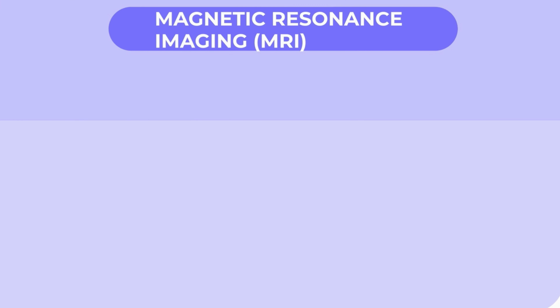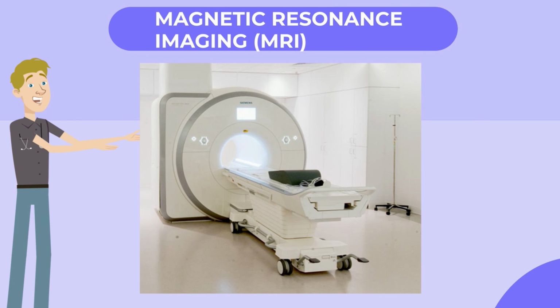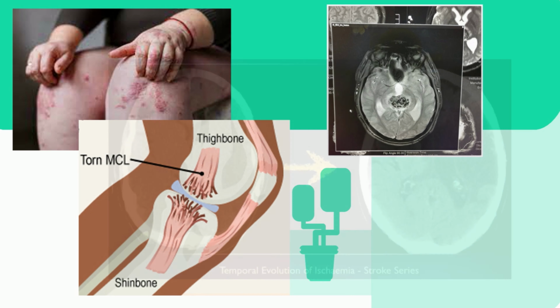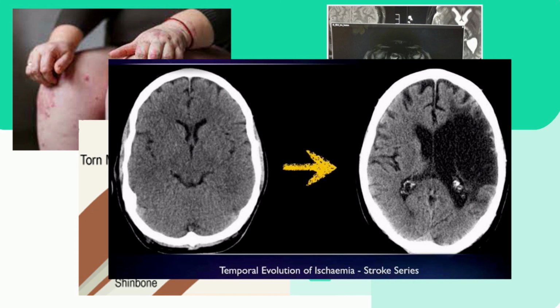We are from Group 5 and our title for the presentation is Application of MRI, or known as Magnetic Resonance Imaging. First of all, what is MRI? MRI is a scanner that has grown tremendously in hospitals. Doctors may order MRI scans to help diagnose multiple sclerosis, brain tumors, torn ligaments, tendonitis, cancers, and strokes.